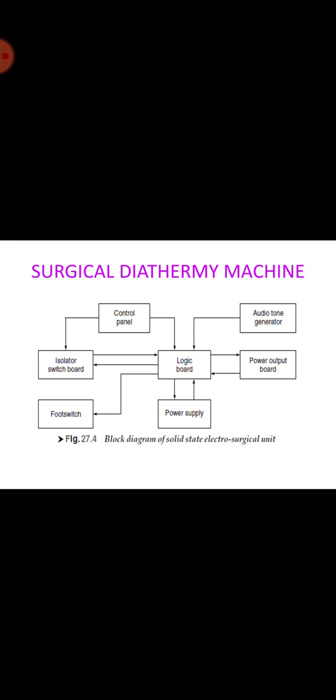In spray coagulation, the electric arcs are deliberately produced between the spray electrode and the tissue, so direct contact between the electrode and the tissues becomes unnecessary. Spray coagulation is used for both surface coagulation and hemostasis of vessels not directly accessible to coagulation electrodes, such as those hidden in bone fissures.